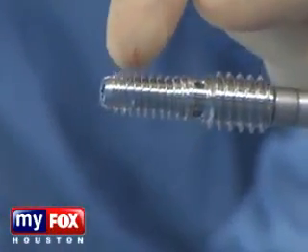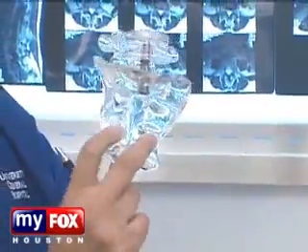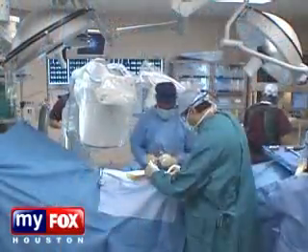And then eventually what we're going to do is insert this, which is the axial rod, which holds things in place until the body can fuse itself. The final result will be what you see here, where the rod is in the L5-S1 disc space.